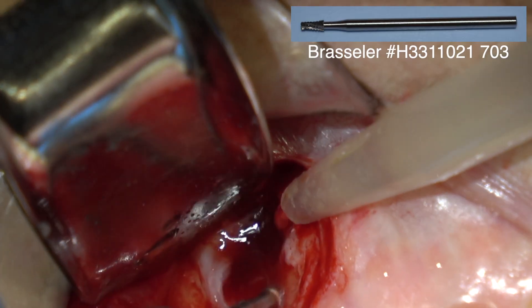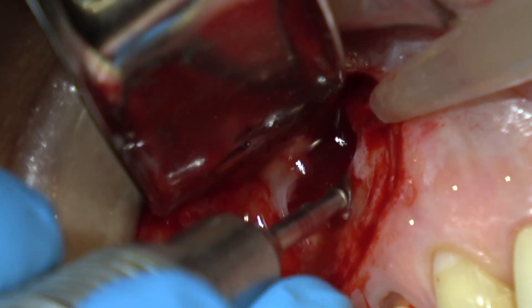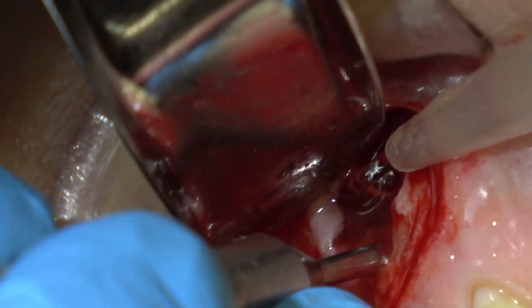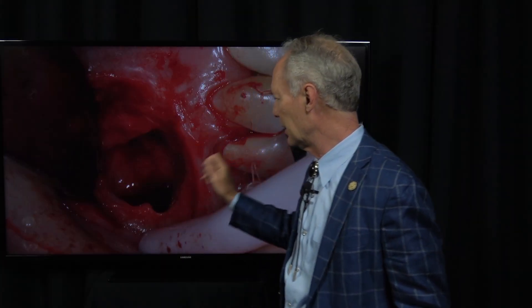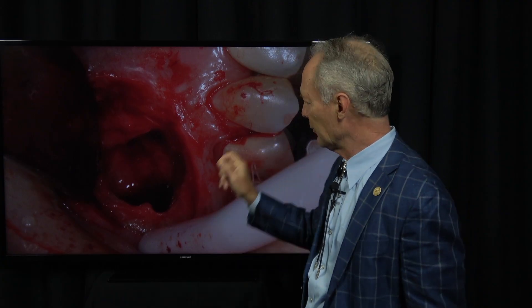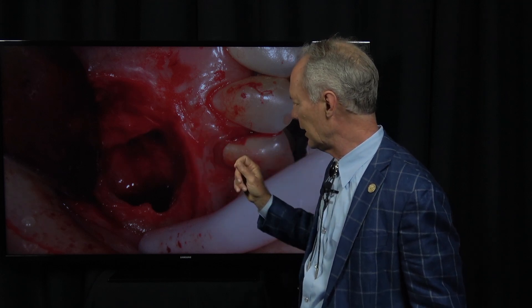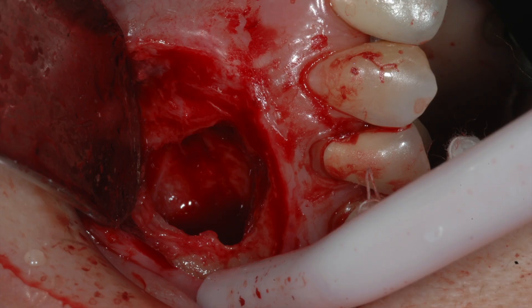I'm rinsing, scrubbing, curetting. You want to be sure that you cut the tips of the teeth off flush with the bone so you can get behind them, get palatal to them, and clean all of that out. Once I've cleaned it all out with a curette and irrigated it, I'm going to go back in with a large cotton ball held with cotton forceps with PeriGuard on it, and just scrub it out. Then irrigate it real well with PeriGuard, which is chlorhexidine. You can see how large that lesion is.